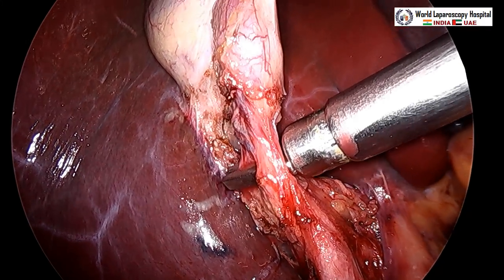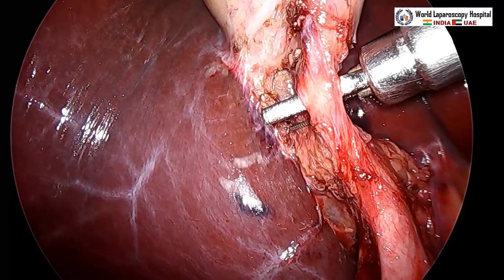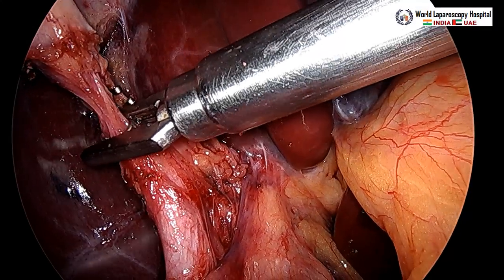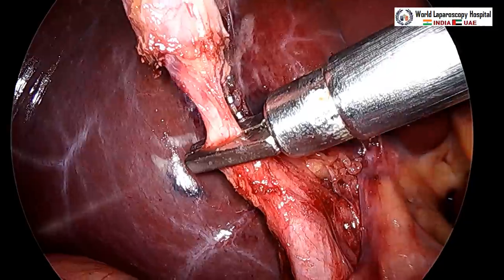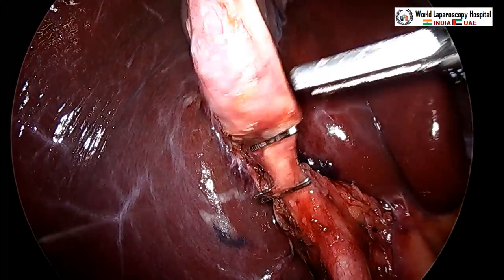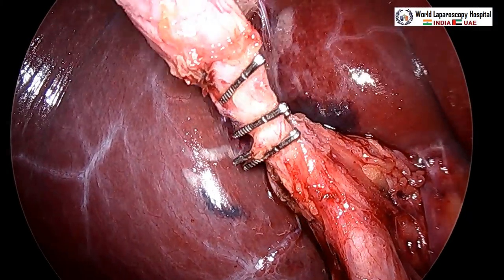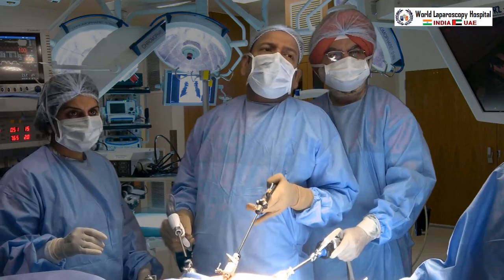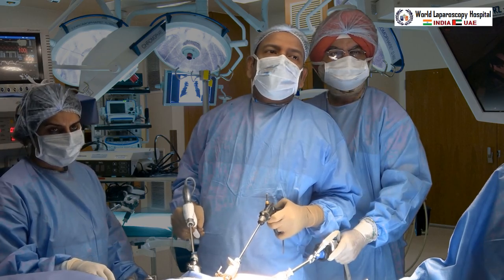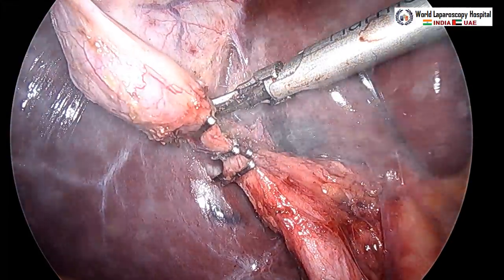Now titanium clips are applied to the cystic artery — two clips are placed. Then three clips are applied over the cystic duct, with the distance between the first and second clip being 3 mm and between the second and third being 6 mm. All clips are in position. The artery and duct can then be cut with scissors or the harmonic scalpel — first the artery is cut, followed by the duct.